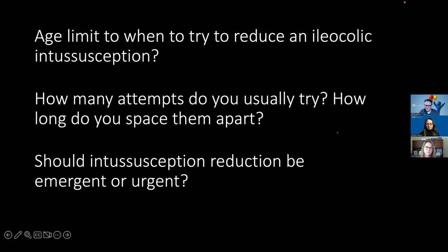Yeah, for older kids, we ace bandage the legs because of course they're going to fight you, and some of them are strong.